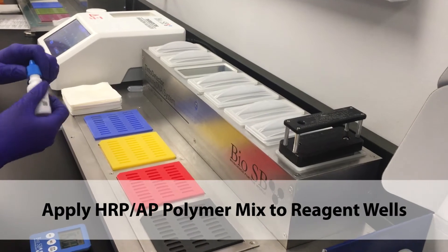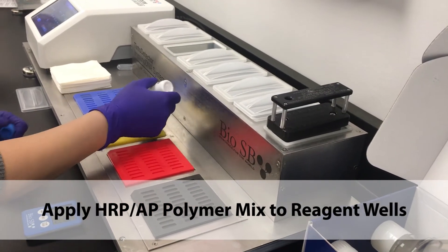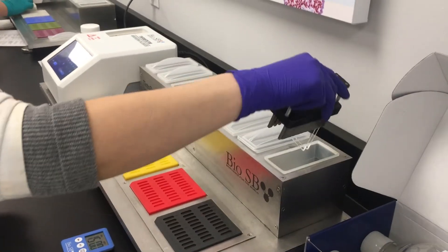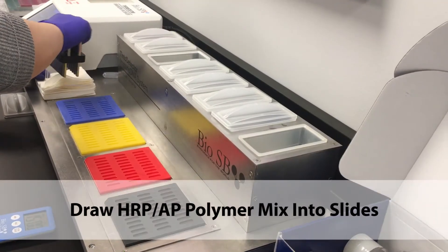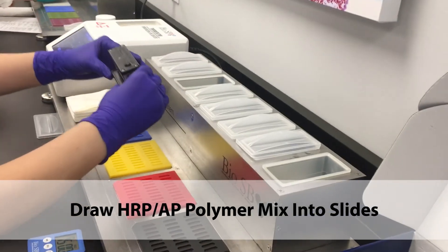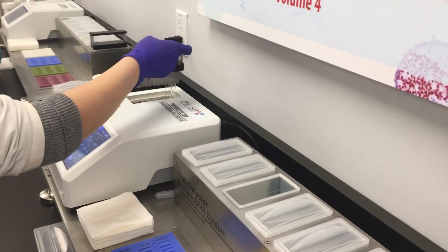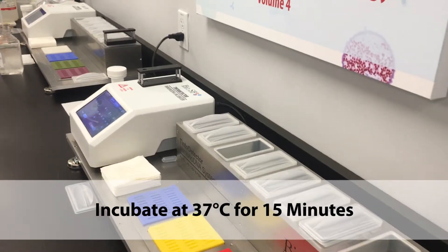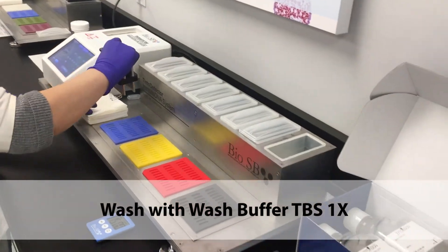Apply HRP-AP polymer mix to the reagent wells. Draw the HRP-AP polymer mix into the slides and incubate at 37 degrees for 15 minutes. Wash with wash buffer.